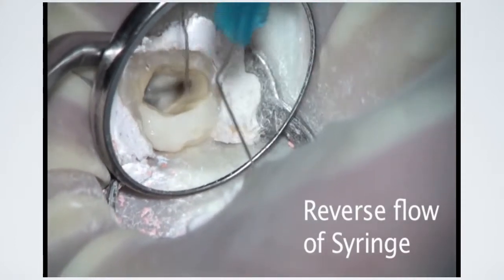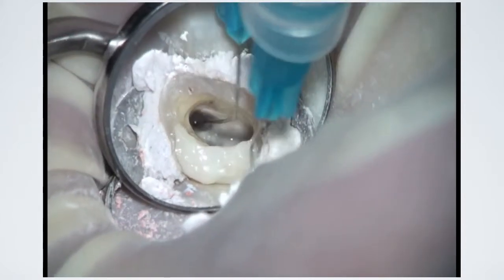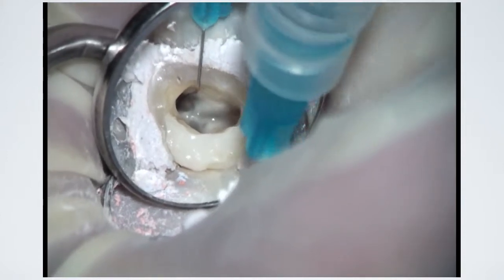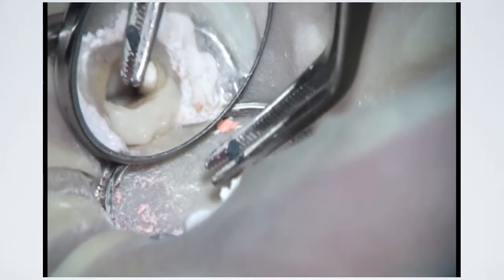Bulk fluid can be removed from the canal by placing back pressure on the plunger of the irrigation syringe. This also decreases the number of paper points needed to dry the canal. 0.04 tapered paper points are then used in order to wick up any fluid that remains in the canal.